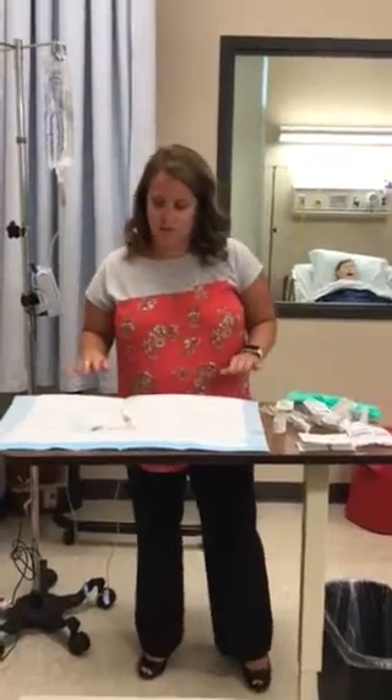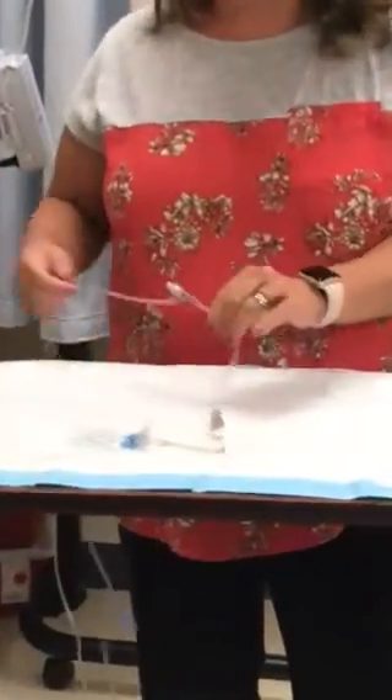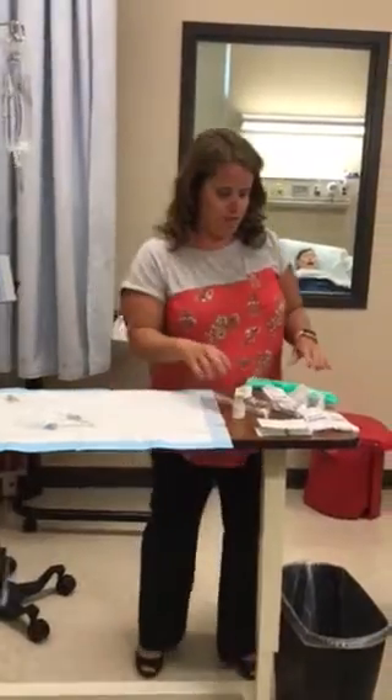This is Nursing 234, skill number two: IV push medication. The first thing we're going to do — our patient already has their IV inserted into their forearm. They're getting normal saline infusing at 15 mils an hour, and we're going to give an IV push medication through that.